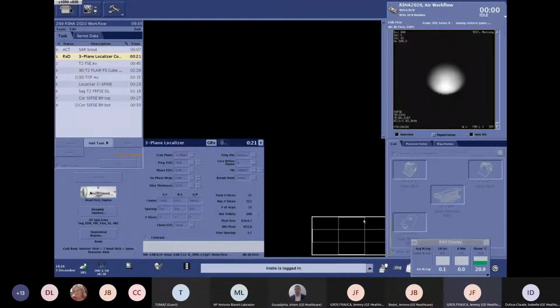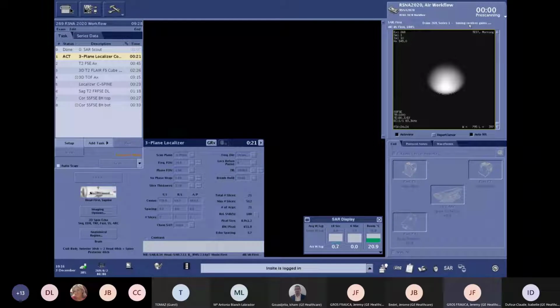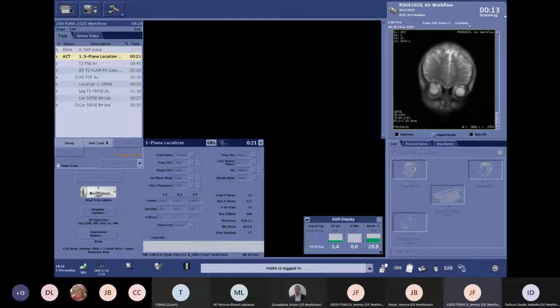While it's running, let me demonstrate a bit more this right bottom corner part of the screen, which is the Airtouch interface. As you remember during the presentation, I told you that Airtouch is this automatic coil element selection. Here you can see that the user only has the coils which are plugged and connected on the table at the moment, and then everything is done by the system automatically. Here you can see that we are running the calibration for coils. So at this moment, the system is creating a sensitivity map where then the system will be able to locate any coil element at any moment in the field of view and to pick the correct one to scan.